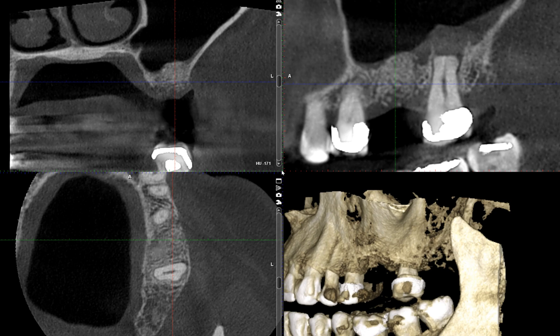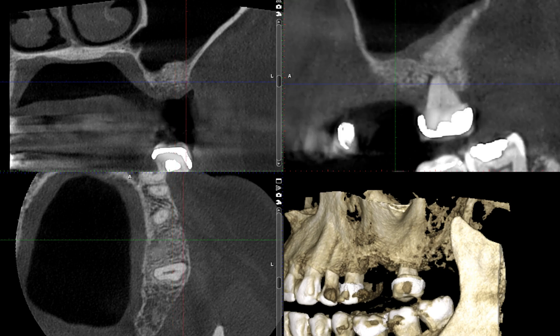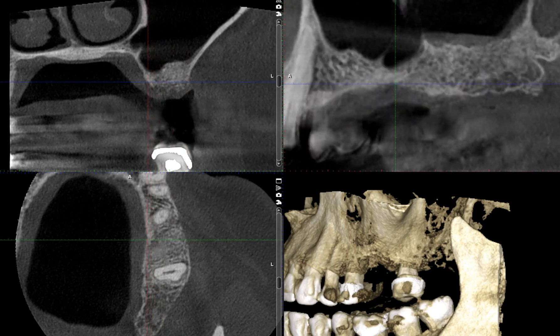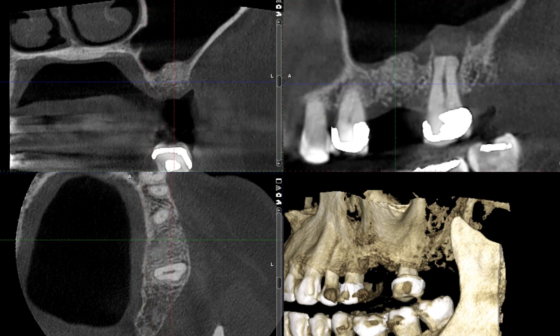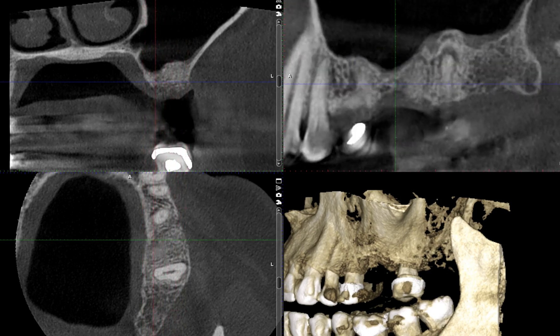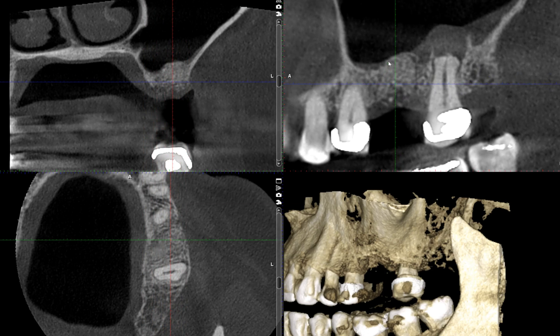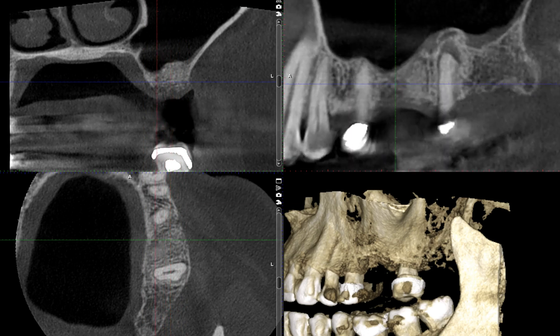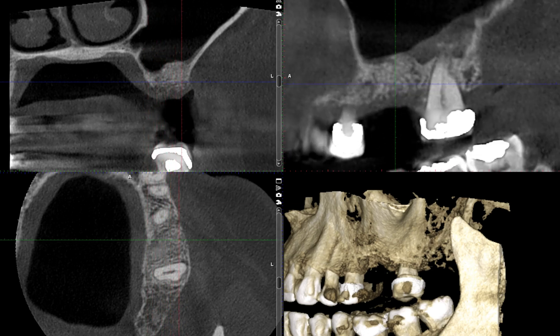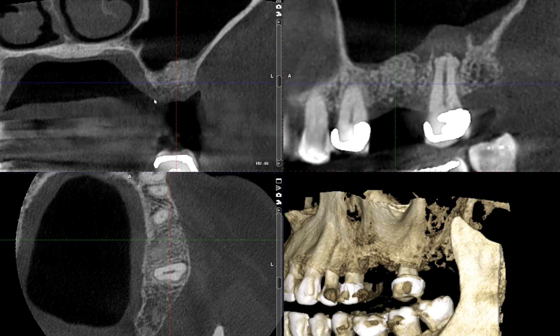Looking at the sagittal view, it's fairly clear that there is graft material which has been fully healed at this point. Let me scroll through the volume — I want you to see the floor of the maxillary sinus that is continuously changing, which can also be seen here.